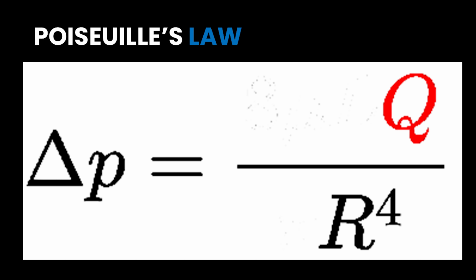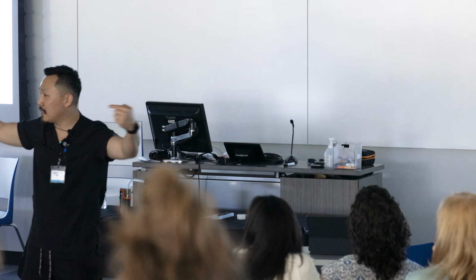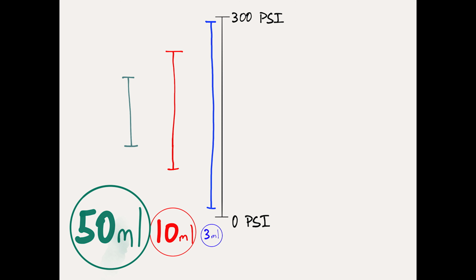Q, you said Q, right? No, you didn't say Q. You said, how hard do we push it? That's the key, and that's Q. Q is the critical factor, and the critical factor is we need to take responsibility. We're the ones with the syringe in our hands. It's not the patients. We're the ones with the needle. Can't keep blaming the patients. So how hard we flush it, how easy it is to reach that high and that low pressure is easier with a skinnier diameter device.